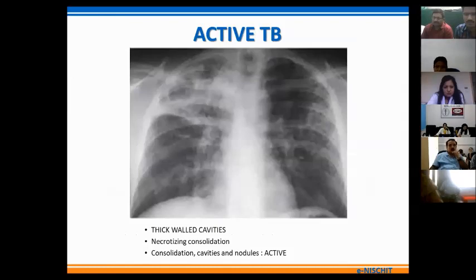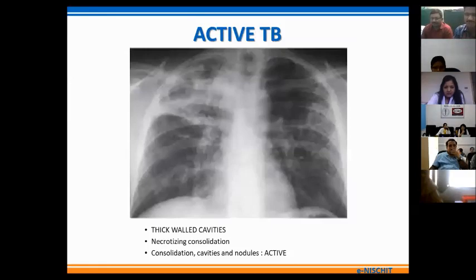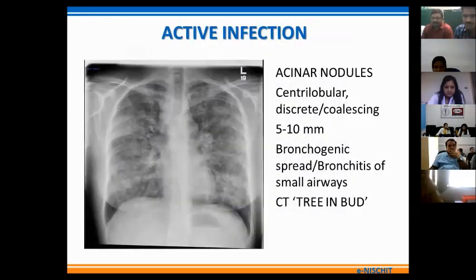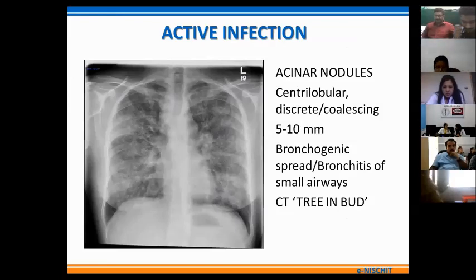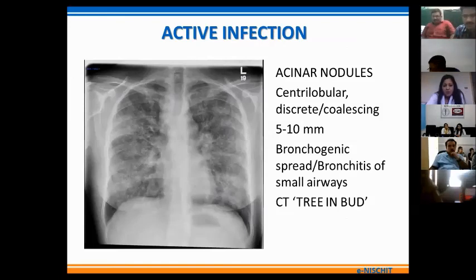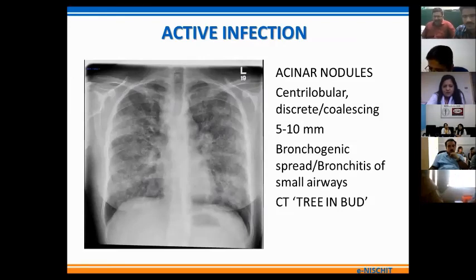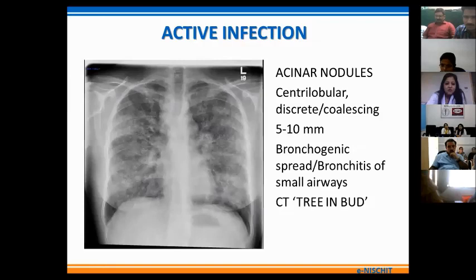This slide again shows the presence of consolidation in the right upper and mid zone with some infiltration in the left lung field also. Another common manifestation of active tuberculosis is the presence of acinar nodules — ill-defined fluffy nodular opacities with a tendency to coalesce, representing the bronchogenic spread of disease. In the chest X-ray, multiple fluffy tiny variable-size nodular densities are shown. On CT, they are seen as areas of tree-in-bud.